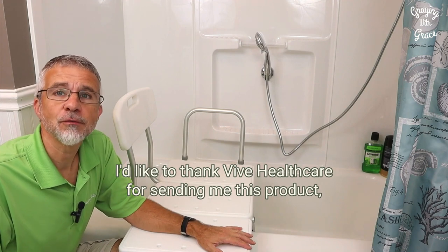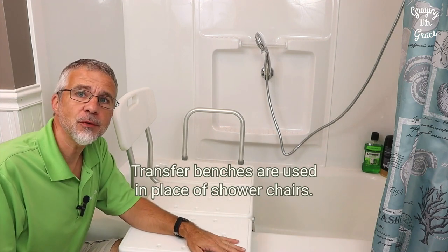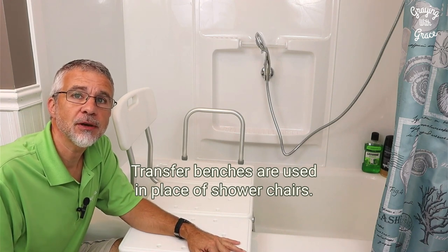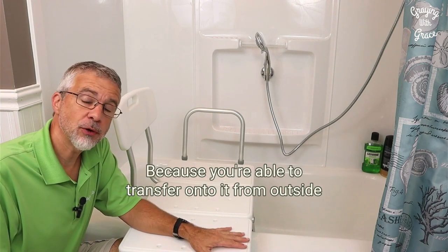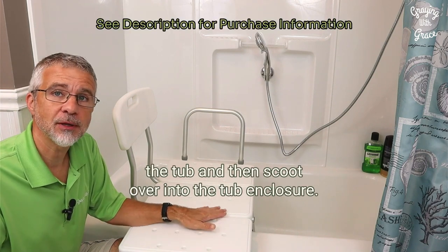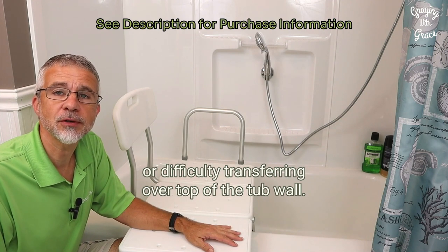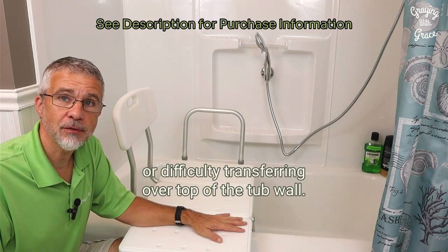I'd like to thank Vive Healthcare for sending me this product so that I can make this demonstration for you today. Transfer benches are used in place of shower chairs because you're able to transfer onto it from outside the tub and then scoot over into the tub enclosure. So it's easier for people that have mobility problems or difficulty transferring over top of the tub wall.